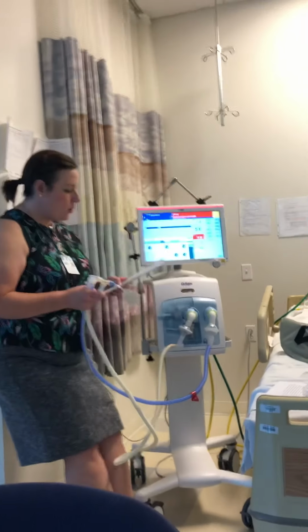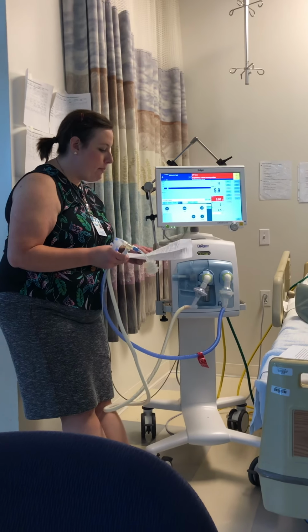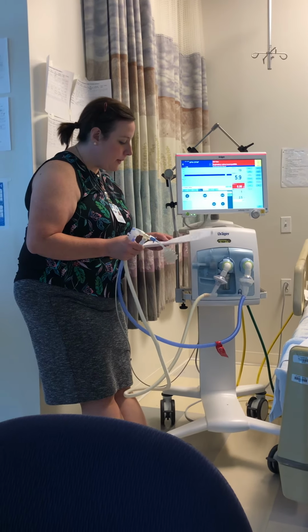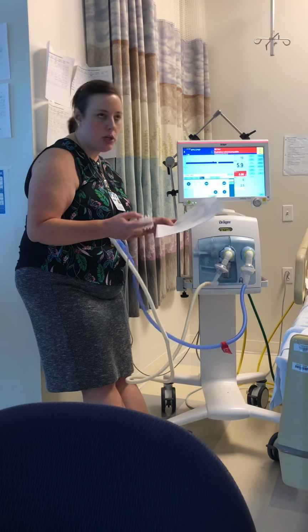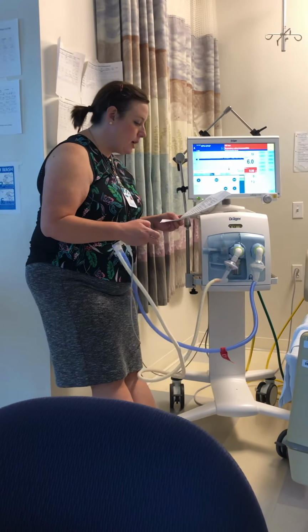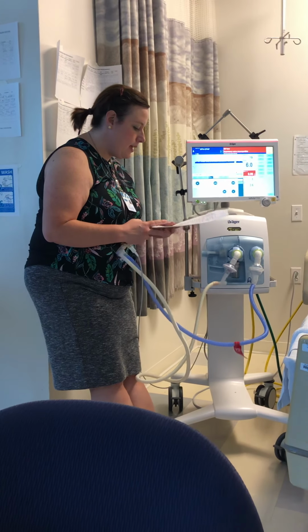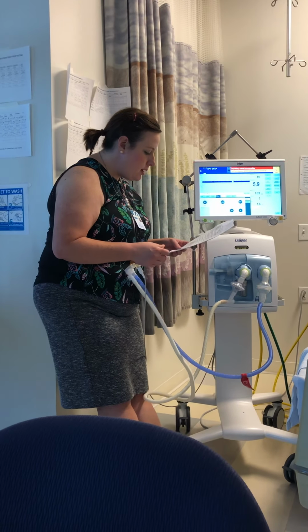Okay, so we've assessed that this is the appropriate level of CPAP and FiO2. We adjusted the alarms depending on the device, established the baseline monitoring with the saturation. We auscultated and determined that these were the appropriate settings for our patient.